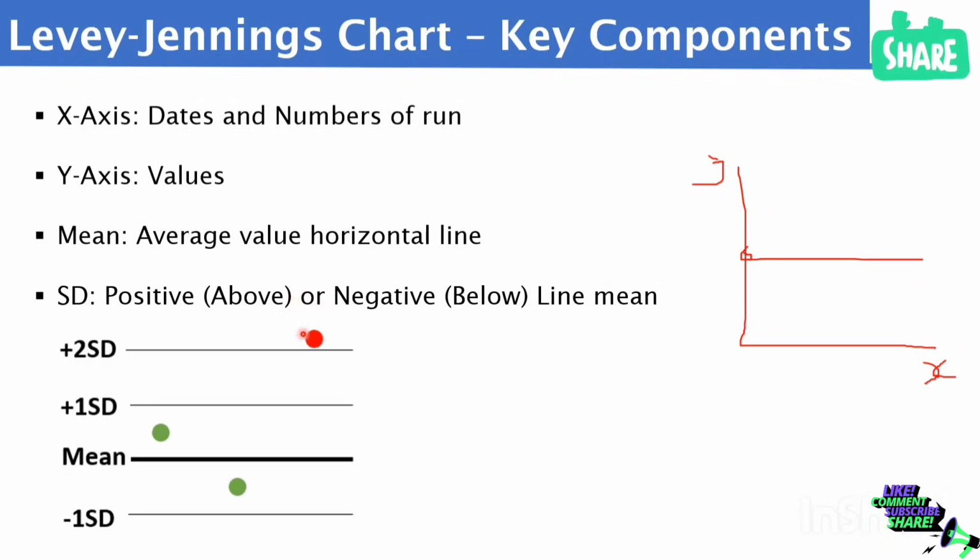What it means is that you may need to retrace your steps, find out what is wrong, and see how you can correct it where possible and repeat it. Perhaps most times it will come back to what it's supposed to be. But obviously, if it continues, something is definitely wrong. So this is just an example of the Levey-Jennings chart.